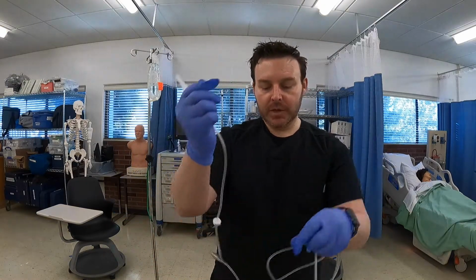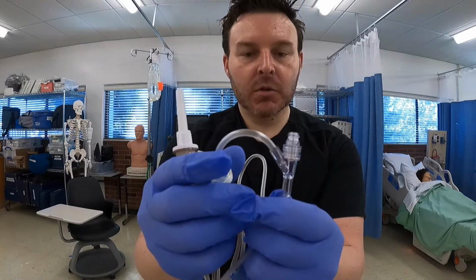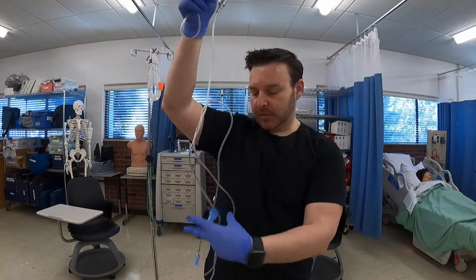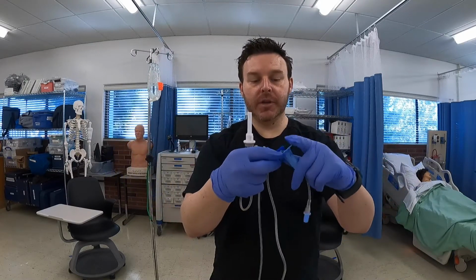A couple other important pieces you'll want to note on this tubing. You have these right here, which are ports which we can inject medication into. You also have a couple different clamps located on this tubing that you want to make sure are open or closed depending on what you're doing.